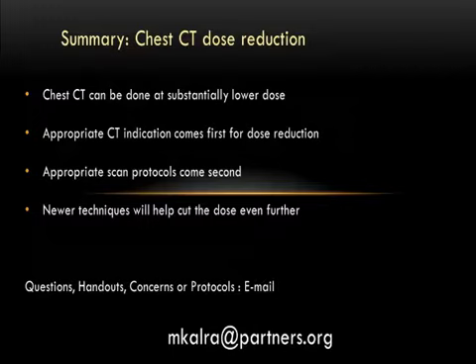The other thing we have noticed is that because of the cardiac CT practice, I recall that cardiac CT, when we started doing them before 2005, used to be our highest dose exam. Today, it is the lowest dose exam of all. One of the chief reasons for that is that most of those CTs are done at 80 kV, compared to the rest of the body regions. So we have taken our lessons from cardiac CT down to the chest regions. And now we have certain protocols, even in abdomen, which are using lower kV. And you will hear tomorrow from Dr. Brendan Nelson as to how he is using lower kV in abdomen more and more with these iterative reconstruction techniques.